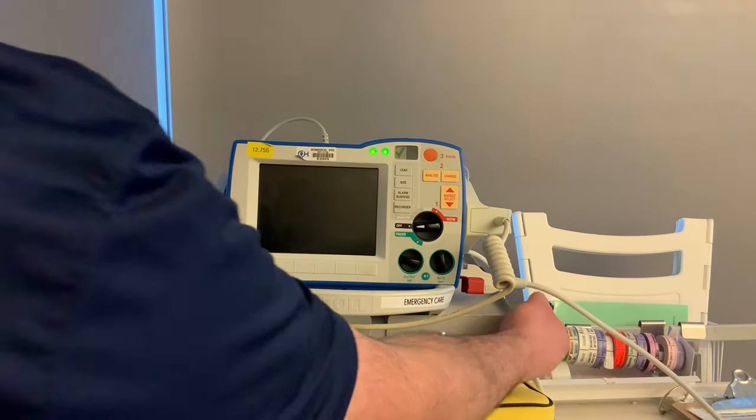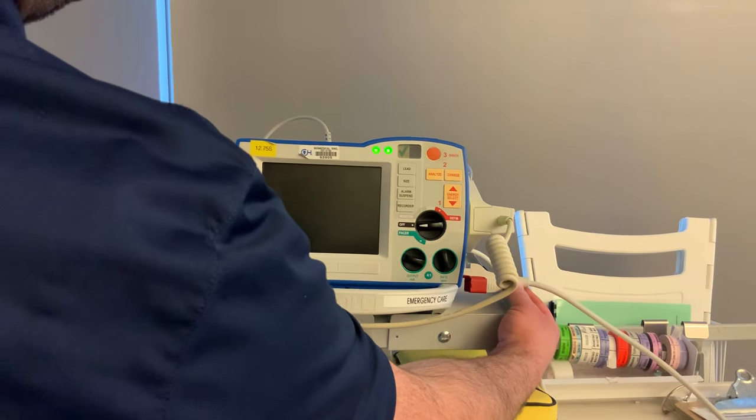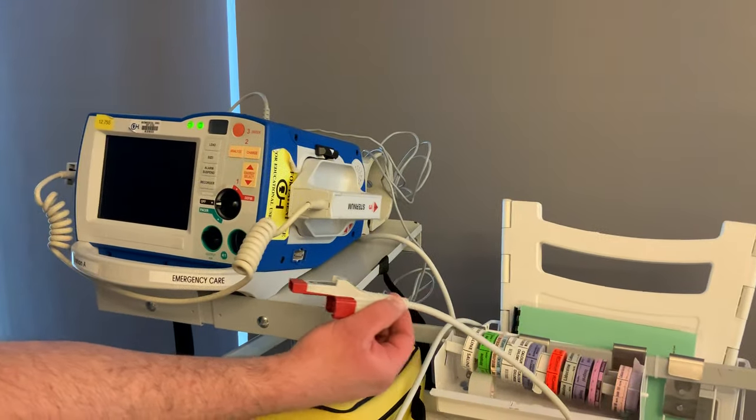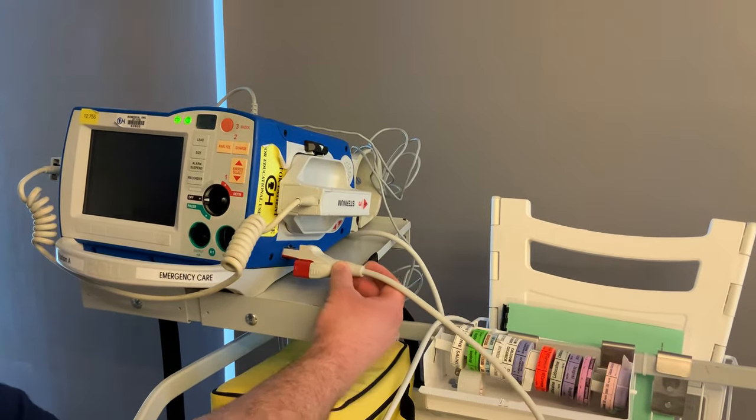On this side you have your therapy cable. Its home spot is going to be on the side here. You would take this out and this is what you connect to your pads — otherwise it's going to live right here in this little spot.